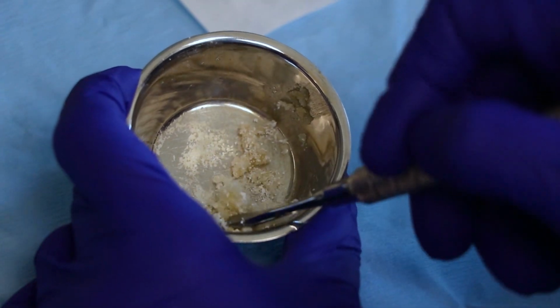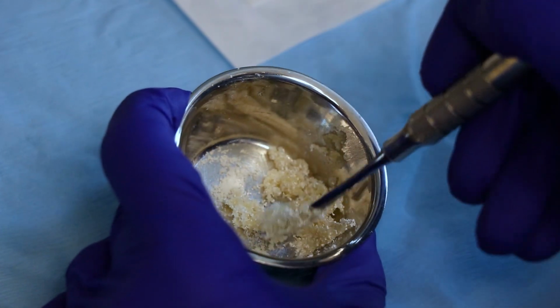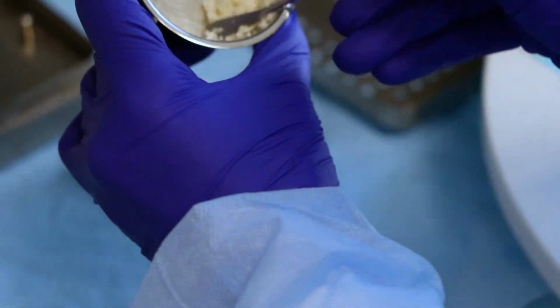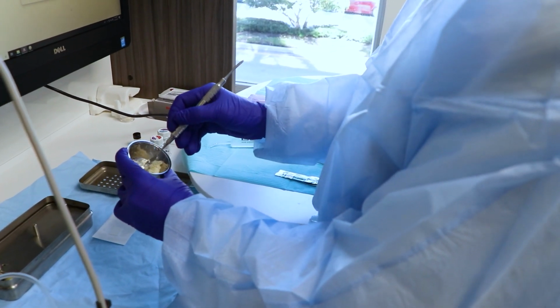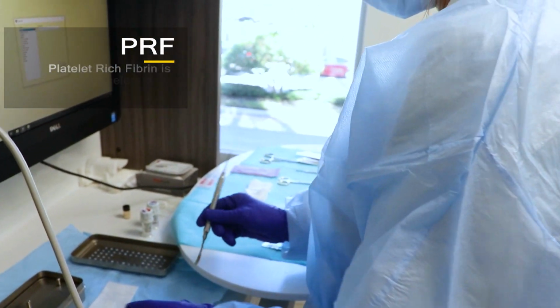If you need me to move it, let me know. And so you can see now how it becomes kind of sticky and almost like a putty, so I'm able to place it where I want without the bone graft material going all over the tissue and falling out. Okay, so that is ready, and we will add some PRF to that later.